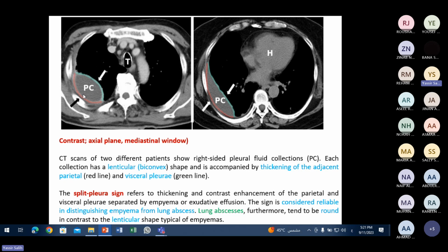يعني ممكن تكون إذا كانت pure fluid بيسميها pleural effusion، لكن it gets infected فthis is an empyema. فإذا لما يكون عندنا empyema characterized by تحصل enhancement of the layers اللي هي of the visceral and parietal pleura. نحن المفروض كان أجيب لكم صورة من غير الكلر دي، لكن حتلقى إن البلورال دي حصل لها enhancement بقت بيضاء.